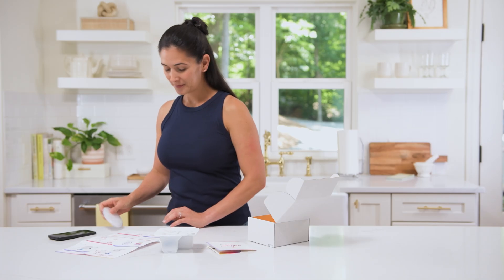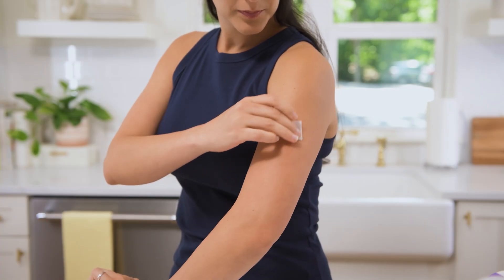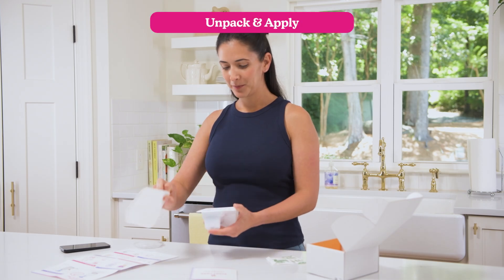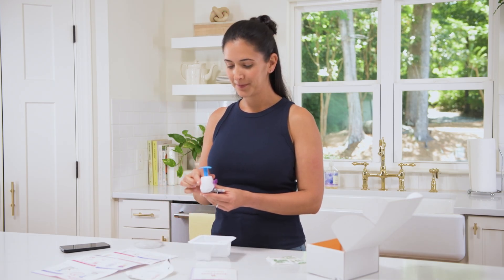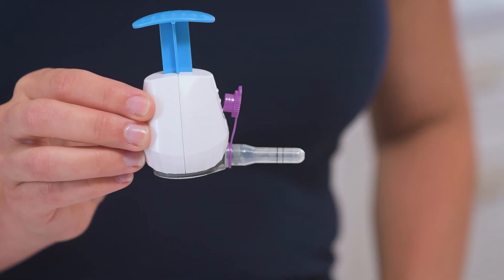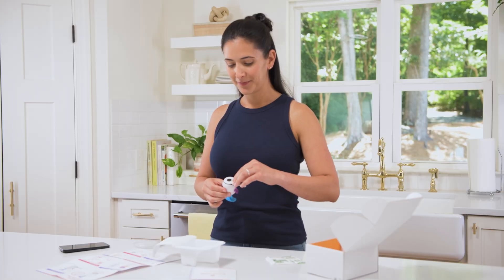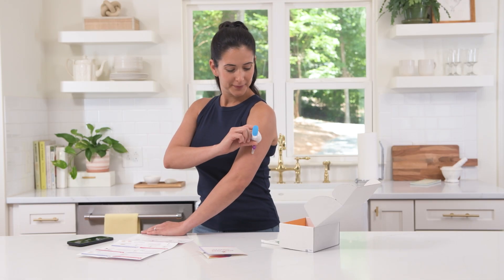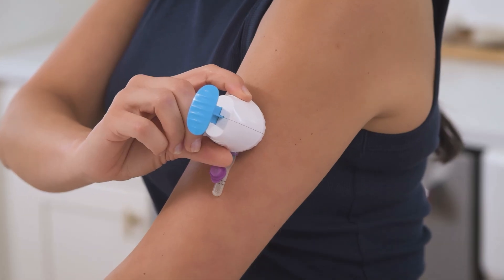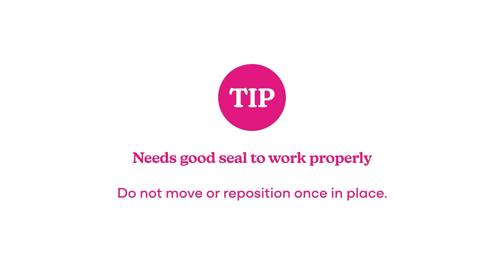When the timer's up, clean the area one last time with the alcohol prep pad. Unpack your Sneak Peek Snap — the collection tube is already attached and you'll see two black lines on the tube. You'll leave the Snap on your arm until your blood fills between those two lines. Peel off the white liner from the bottom, position the Snap with the collection tube pointing toward your elbow, and press it firmly onto your arm. It needs a good seal to work properly, so once it's in place, don't move or reposition it.